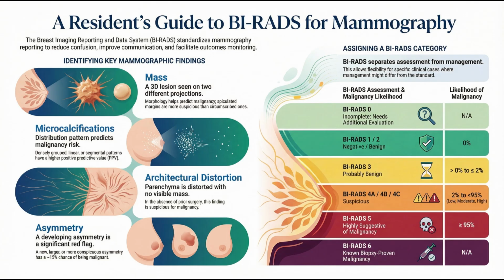Got it. What about calcium that's related to blood vessels? Those are vascular calcifications. They look like parallel tracks or little linear tubes, and you can clearly see they're following the path of a blood vessel. Then you have dystrophic calcifications. They're irregular, bigger than a millimeter, and they often have these lucent centers. Lucent centers. That sounds odd for a calcification. What does that mean? It means the calcium has deposited around dead or dying tissue, necrosis. So the very center looks sort of translucent. It's a known benign healing response, often after trauma or something.